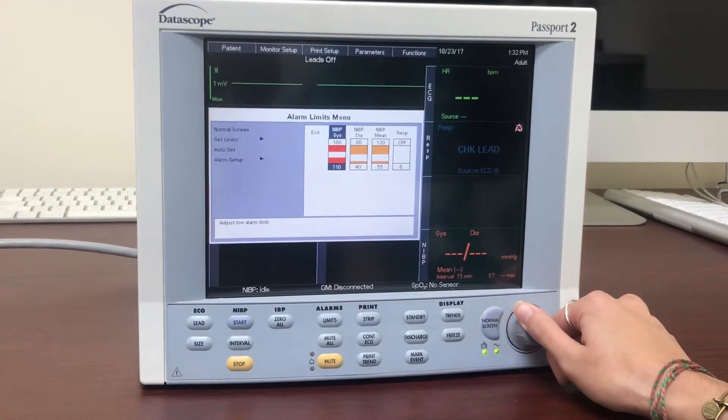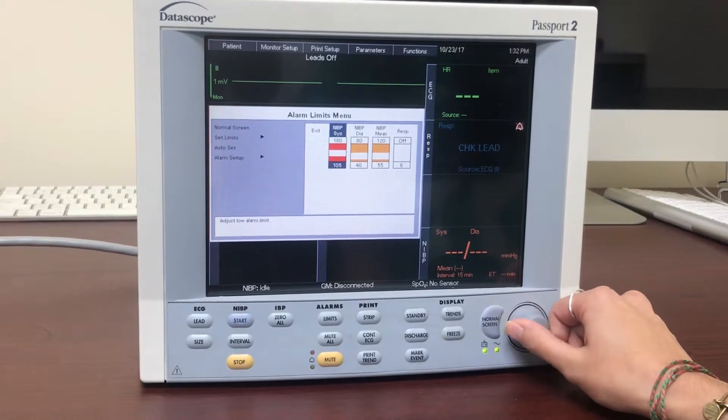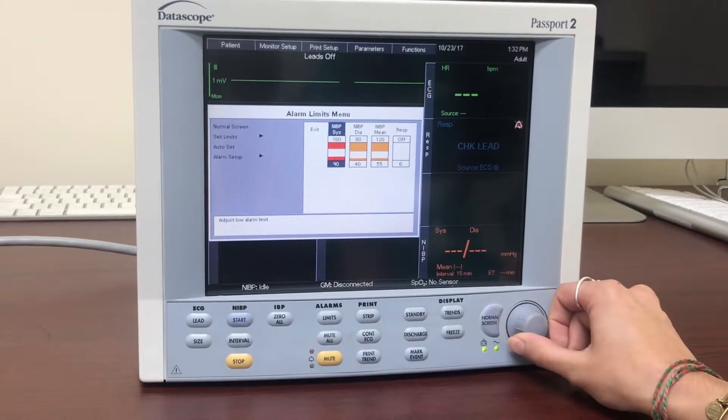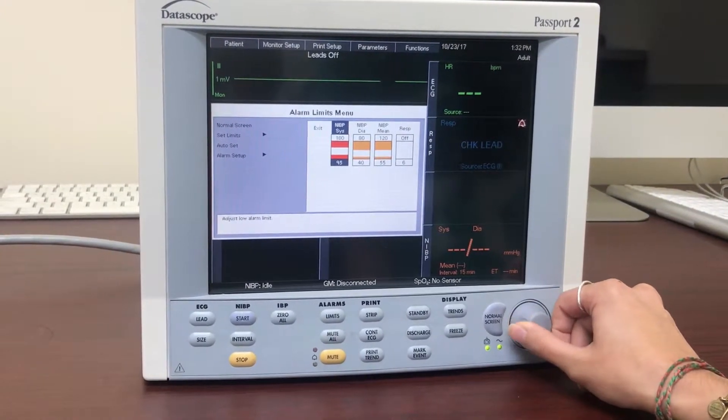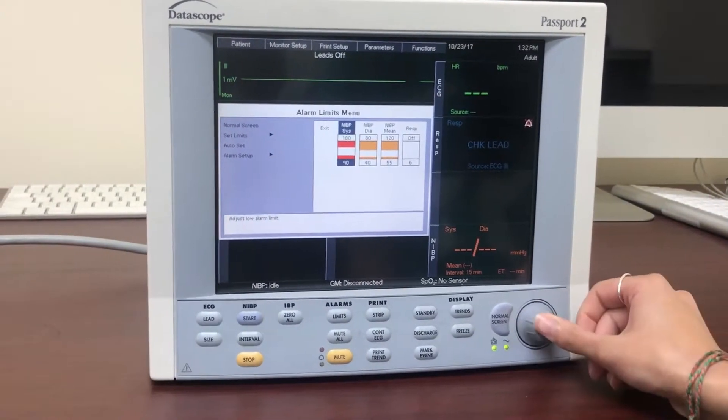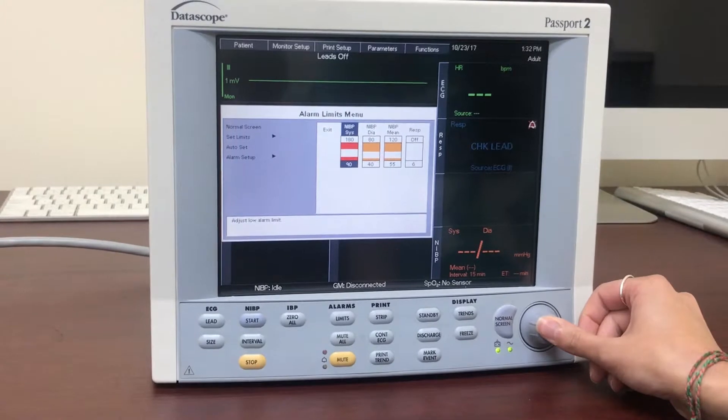The first click will change the upper limit, the second click will change the lower limit, and the third click will return you to the menu.